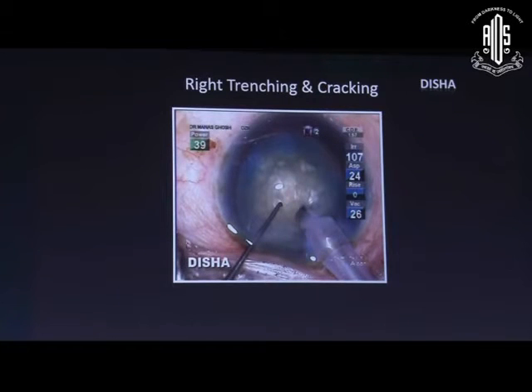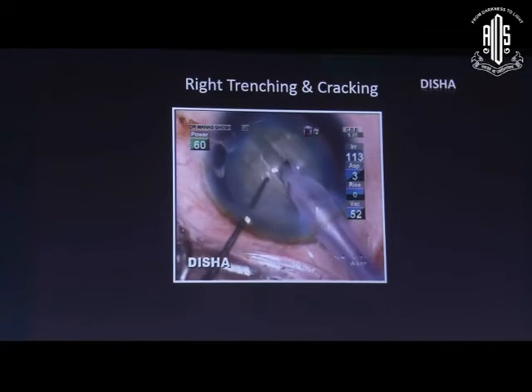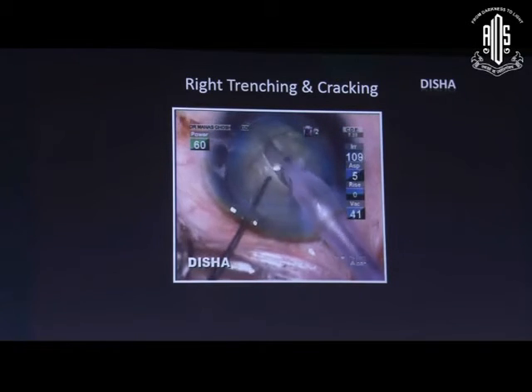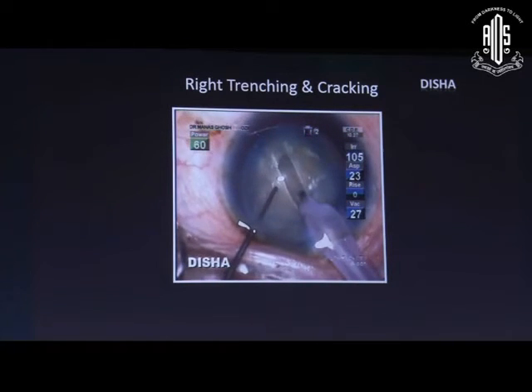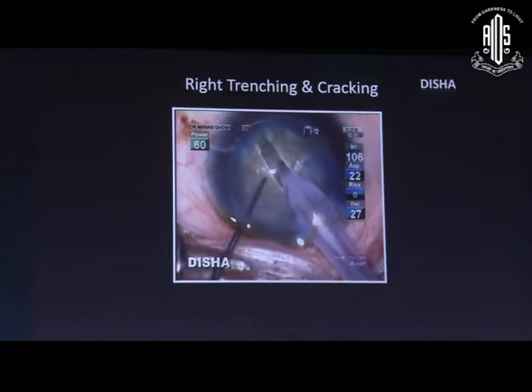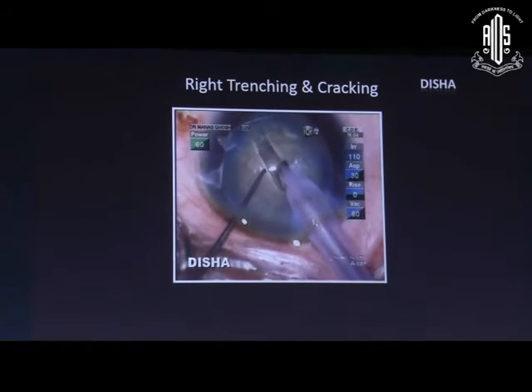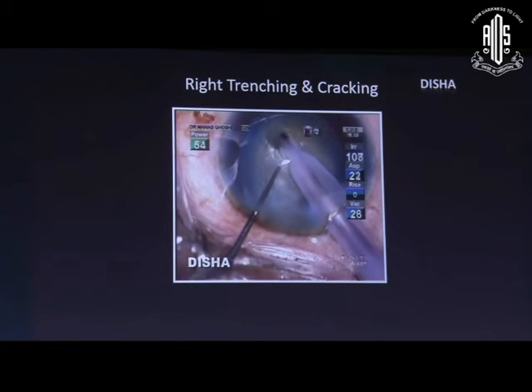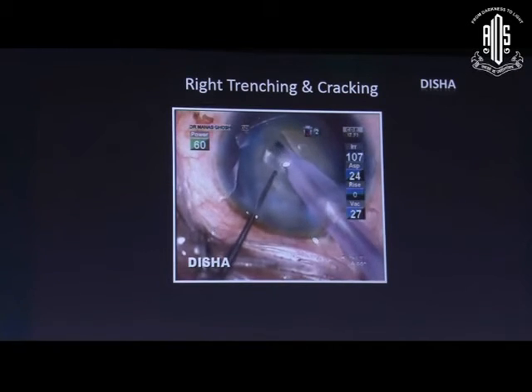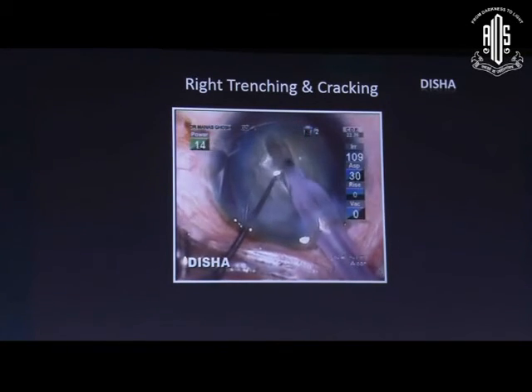This video demonstrates how to do right trenching and cracking. The trenching is initiated just in front of the rhexis margin at 12 o'clock and should stop just in front of the rhexis margin at 6 o'clock — one-third of the needle should be engaged during trenching. When one side is completed we need to rotate. It is always better to rotate initially using two instruments. During deep trenching we need to maintain an adequate tunnel width of 1 to 1.5 times the phaco needle width.